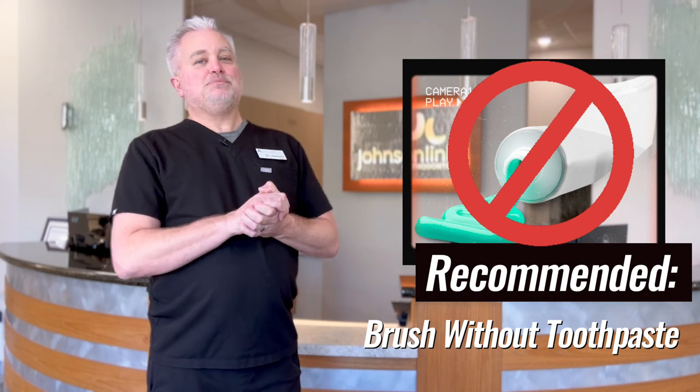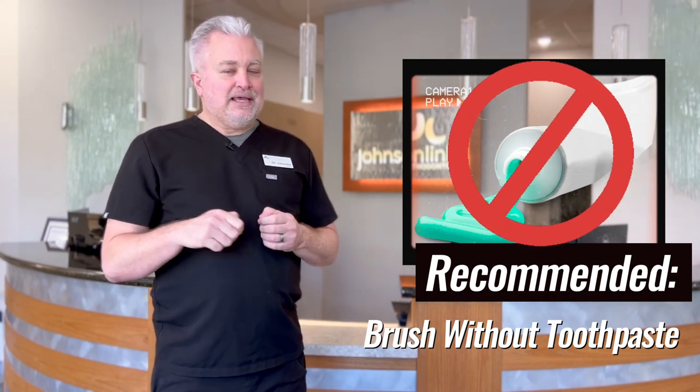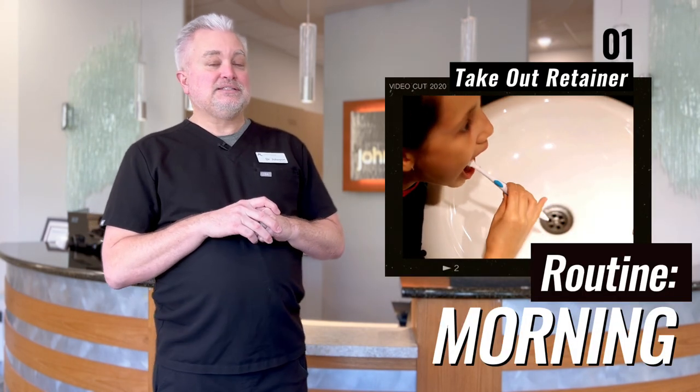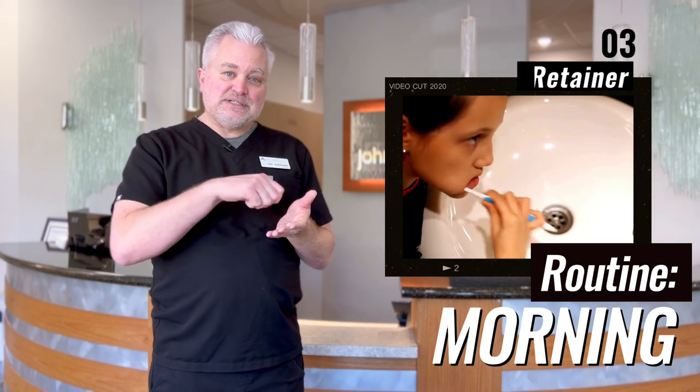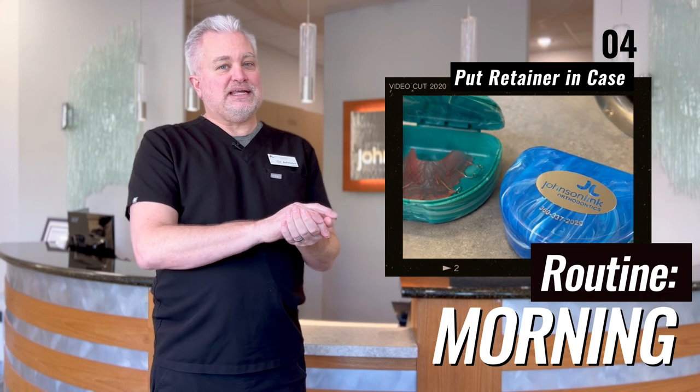We recommend brushing them without toothpaste — not that toothpaste is super bad, but toothpaste has a little bit of grit in it, and the more you use it on your retainer, the more of the shine it takes away, making it easier for bacteria and other stuff to get caught in the retainer. So when you take your retainers out in the morning, brush your teeth, brush your retainer, put your retainer in its case, and it's ready for the next night.